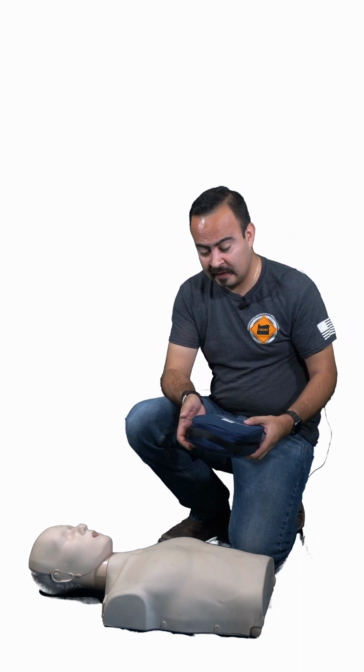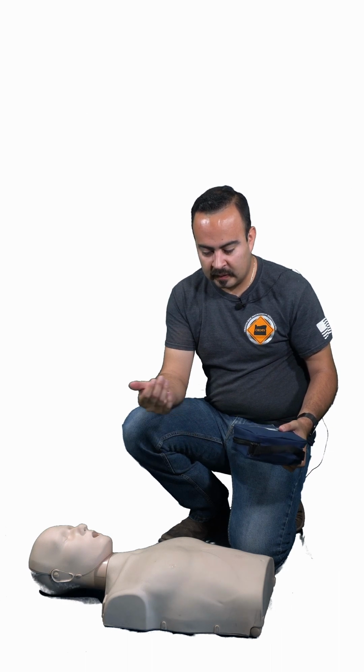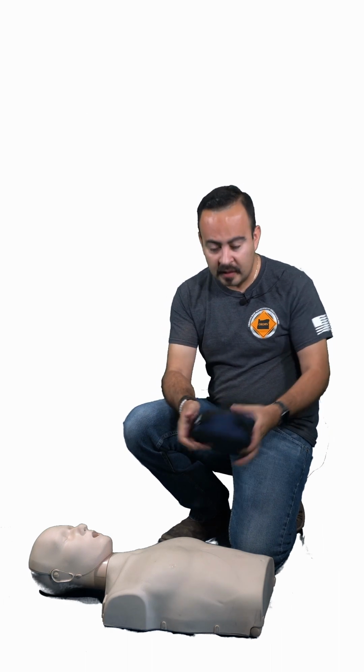The purpose of this device is to not shock the heart back into rhythm, but rather to stop it so that the heart's sinoatrial node, otherwise known as the SA node, can reset itself and get the heart back into normal sinus rhythm. So in the event of somebody suffering cardiac arrest and undergoing CPR, a second rescuer will come in with an AED and apply the pads as CPR is being done.